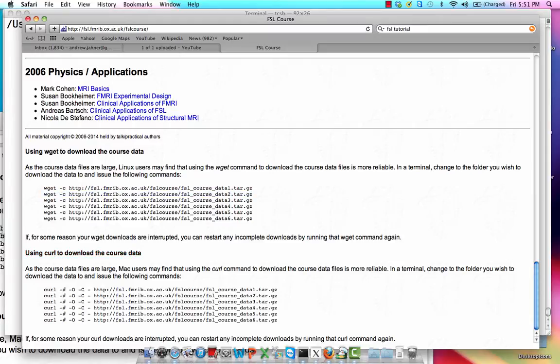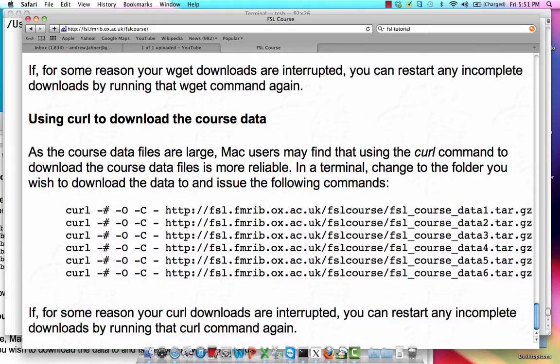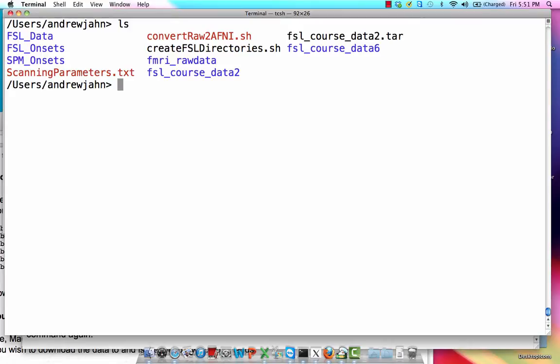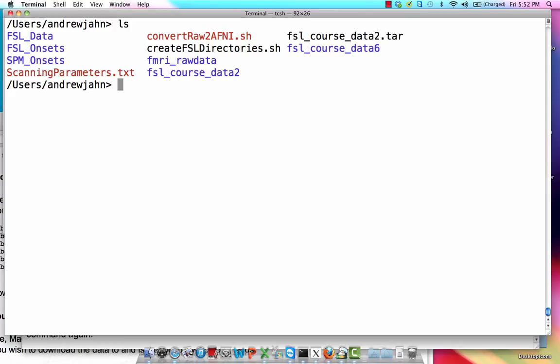Download both data two and data six. We're going to focus mainly on data two, but also get data six because we'll talk about that a little bit later. Once you've downloaded it, remember to gunzip it — it's going to be gzipped, so use gunzip followed by the name. Then you'll get the tape archive and do tar with the dash xf flag followed by the name of the data set. I also recommend renaming it because you'll just get something that says 'FSL course data,' and you don't want that conflict. So just remember to rename it with the appropriate number.